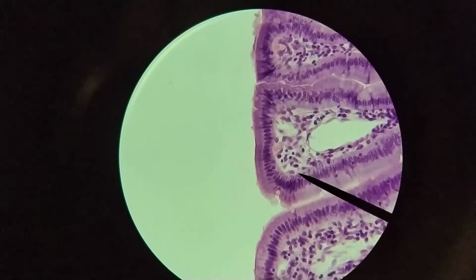Okay, so again, nice neat row of nuclei, simple columnar epithelium with a brush border. We can say this is kind of a dark line on the surface. So we've got microvilli there, again, very absorptive epithelium.